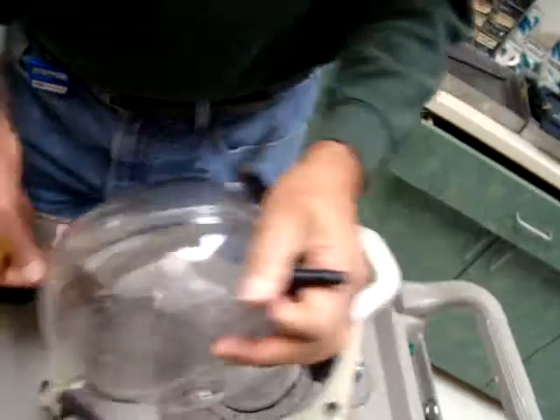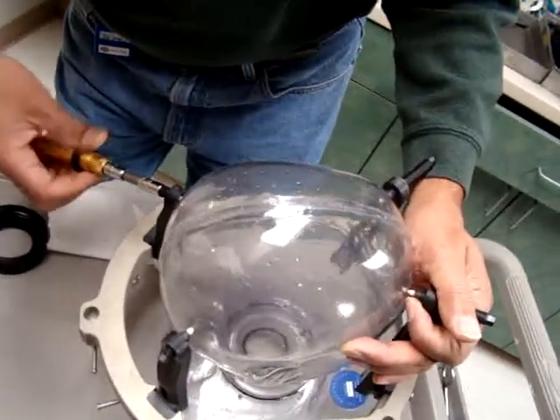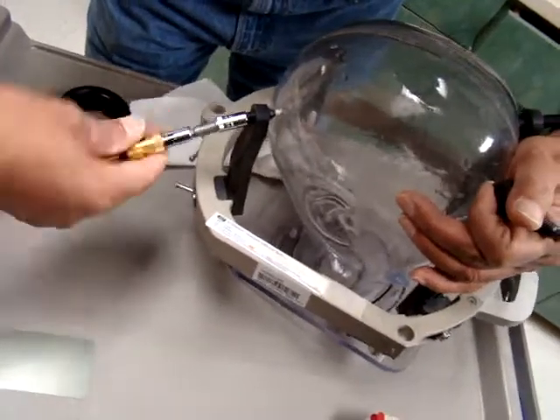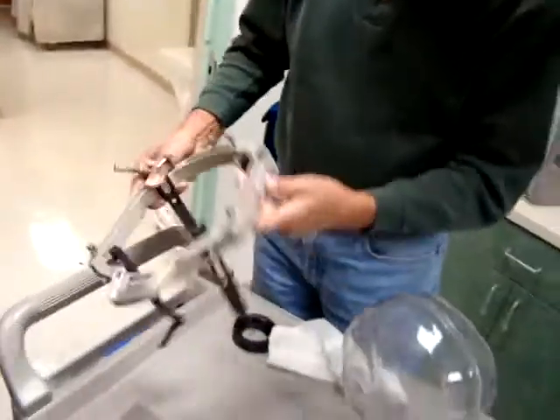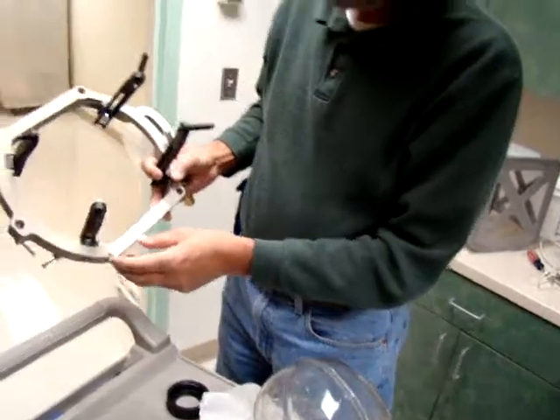You don't want to make a hole in the head. After this, we send this head frame for sterilization, and now this frame goes for sterilization. This is used on the patient, so after one-time use you sterilize it.